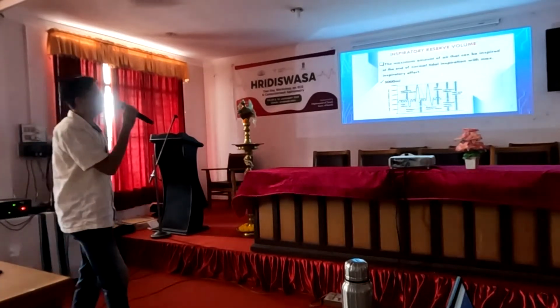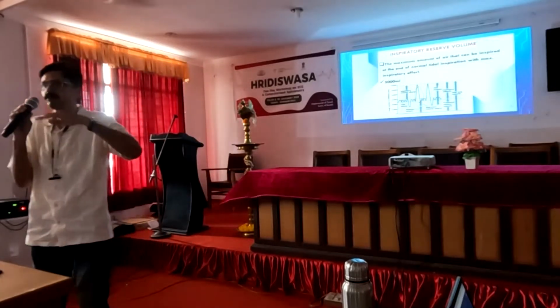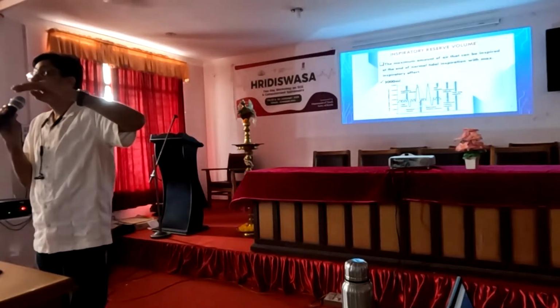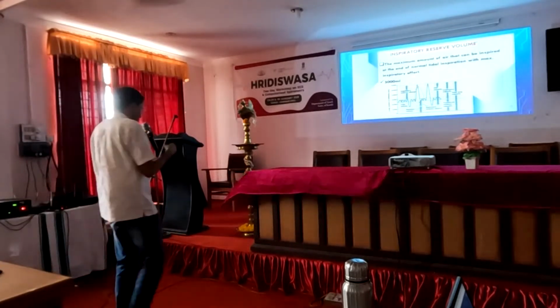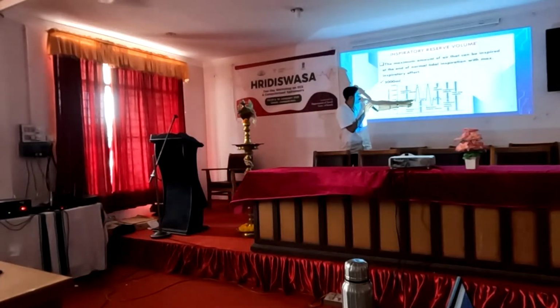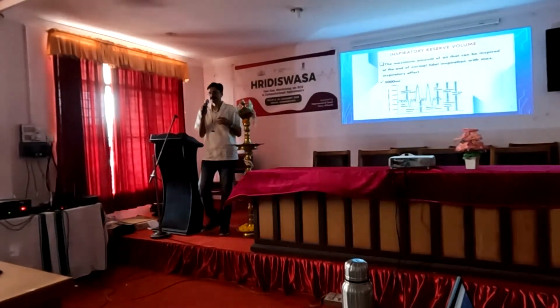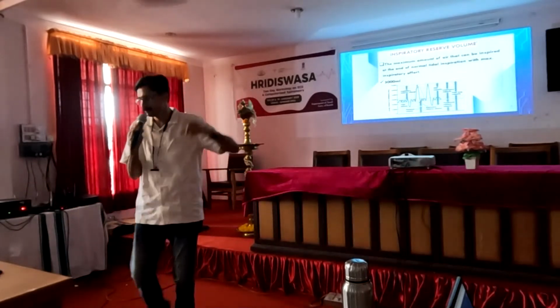Next, inspiratory reserve volume. So what is inspiratory reserve? Tidal volume we know. It is the maximum amount of air that can be inspired at the end of normal tidal inspiration. In the spirogram, we will get that picture, then it is very easy. After the normal tidal inspiration, the maximum volume of air breathed in with the maximum inspiratory effort from the tidal inspiration. Clear? The volume of air that can be inspired at the end of normal tidal inspiration.